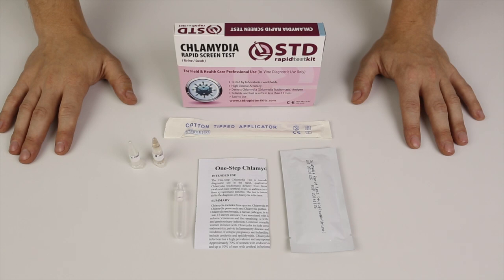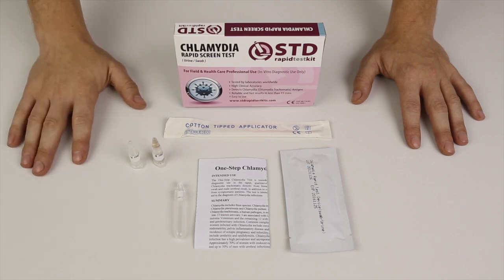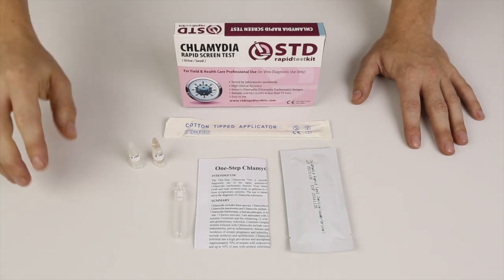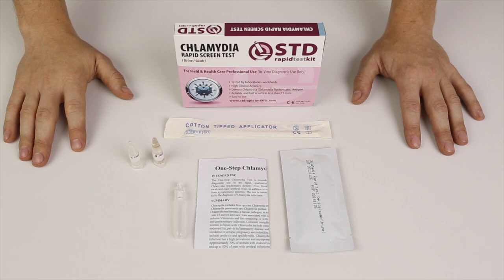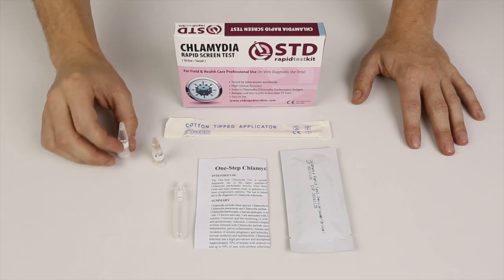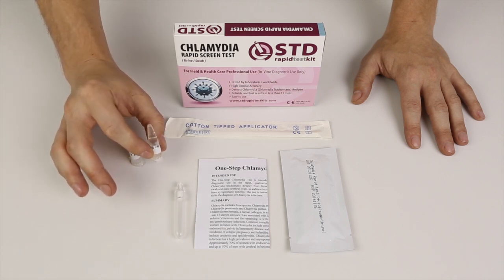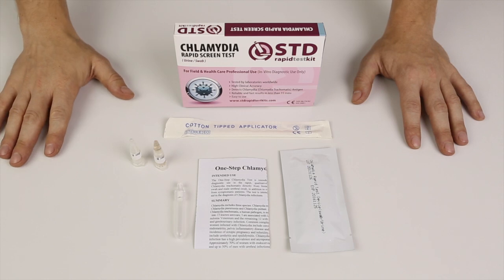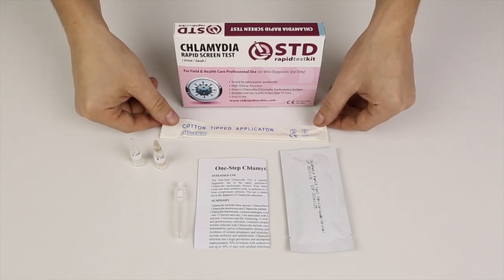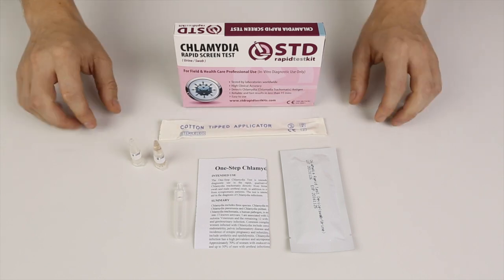So first of all, it will arrive with the instructional sheet. You'll have the mixing tube, you'll have what is called buffer A and buffer B. And you'll have one swab that looks like this, and then of course the test cassette itself.